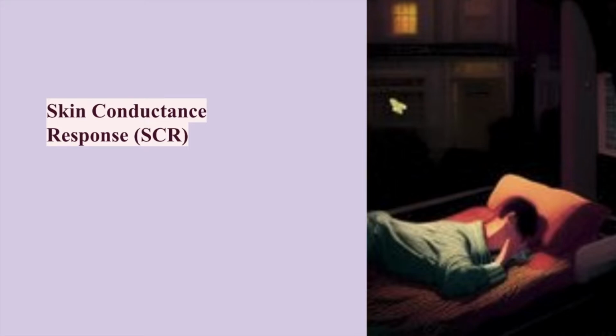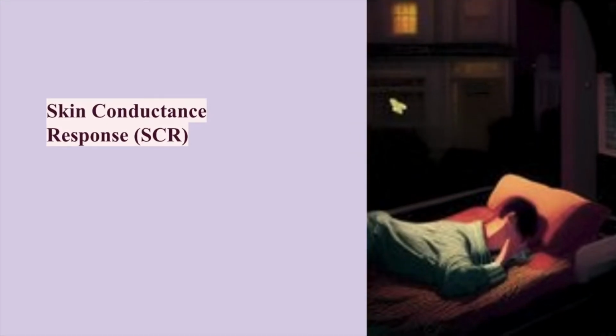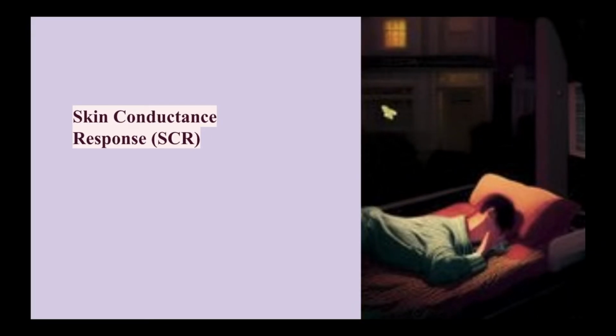Value from experience, which is in alignment with scientific literature, suggests that a relaxed frame is between 0 and 5 SCR per minute. 6 to 9 SCR per minute starts an animated state. 10 or even from 16 SCR per minute, a level of stress or even high stress can be assumed in this case. The SCR are greater comparing biofeedback sessions to each other.